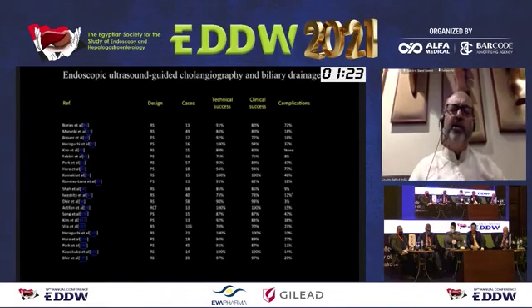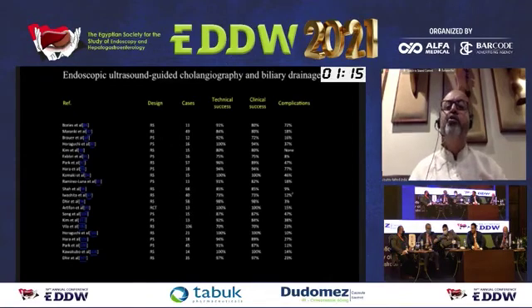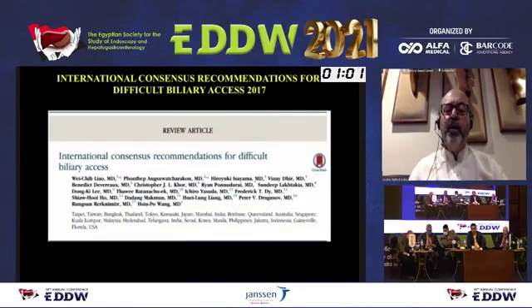There are a lot of studies regarding EUS-guided cholangiography and biliary drainage. The complication rates have been extremely high because of a very steep learning curve. So I would only do this procedure if you have adequate experience in handling thousands of EUS-guided interventions, especially FNA, as a background, to have a mastery in this area.